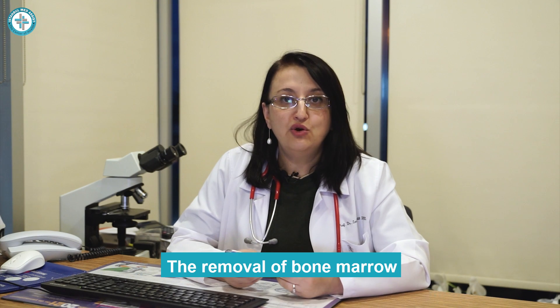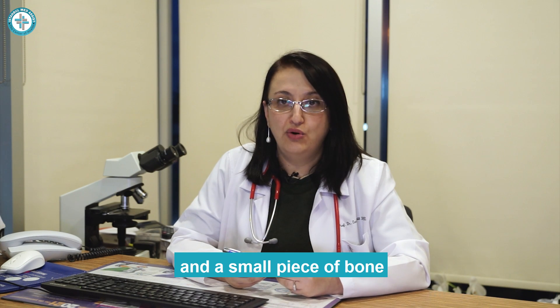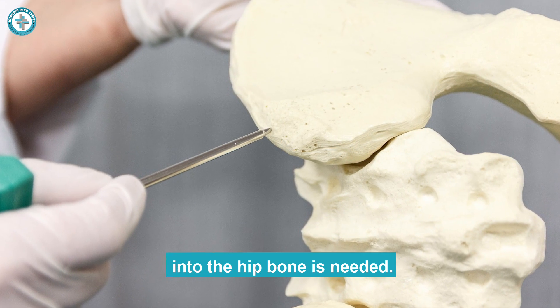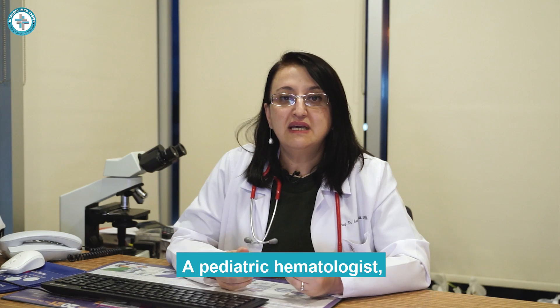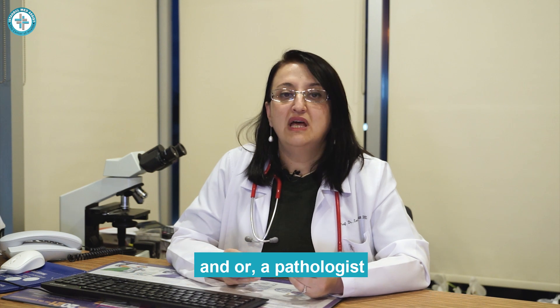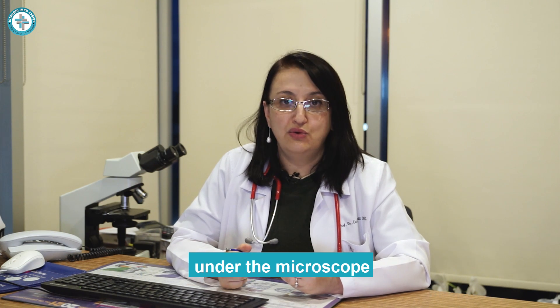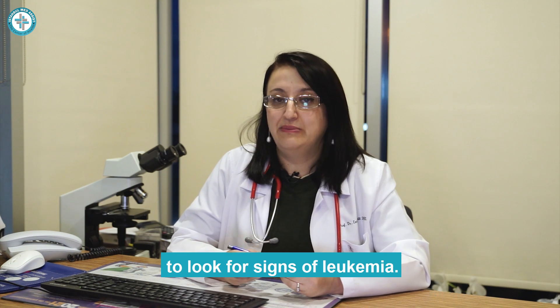The removal of bone marrow and a small piece of bone by inserting a hollow needle into the hip bone is needed. A pediatric hematologist and/or a pathologist can examine bone marrow aspiration smears under the microscope to look for signs of leukemia.